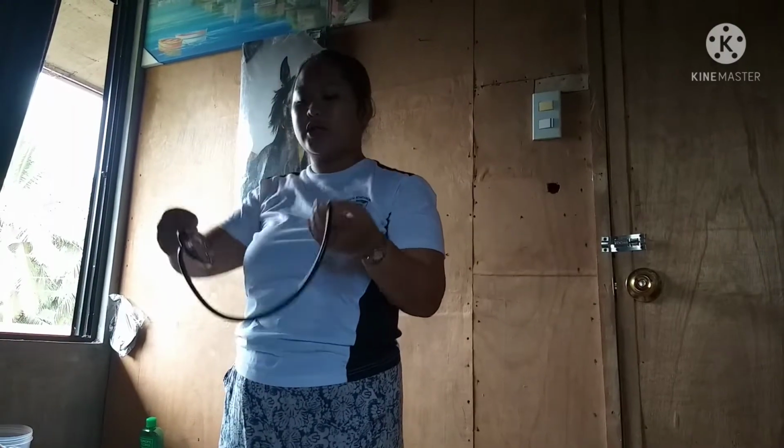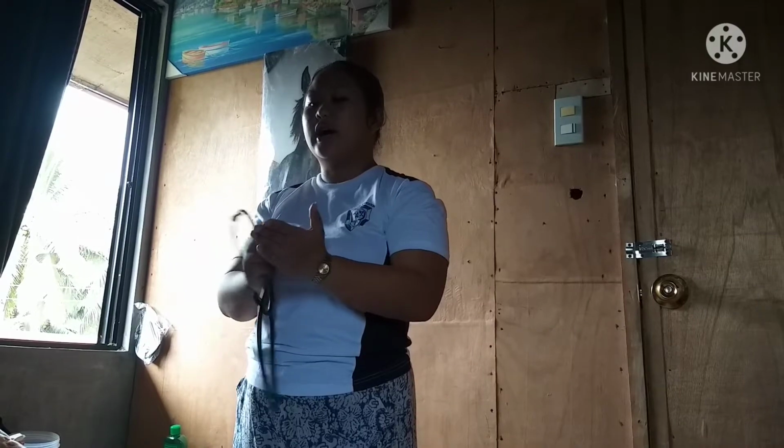Warm the diaphragm of the stethoscope with your hand before applying it to the patient's chest. Placing a cold diaphragm against the skin may startle the patient and momentarily increase the heart rate.